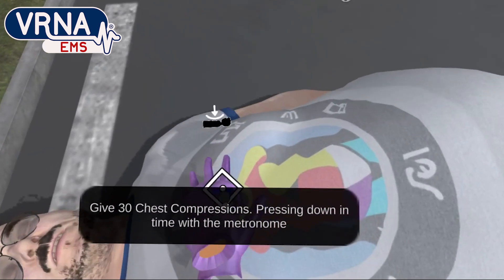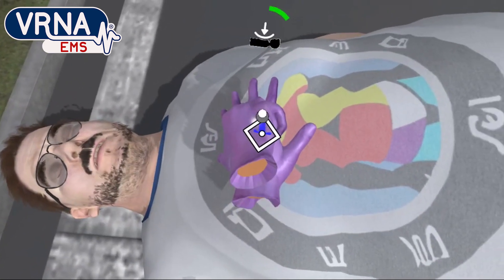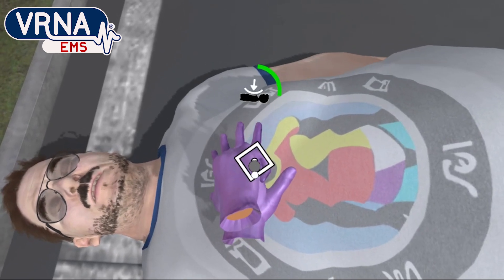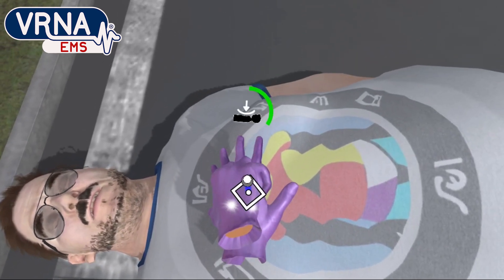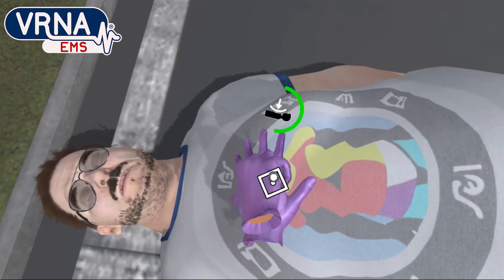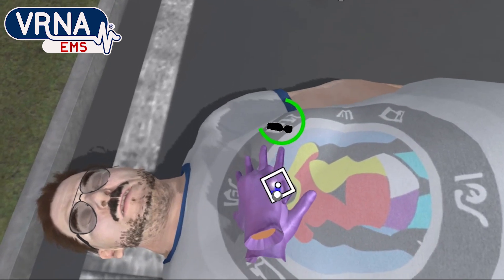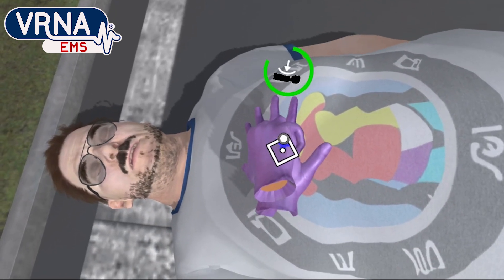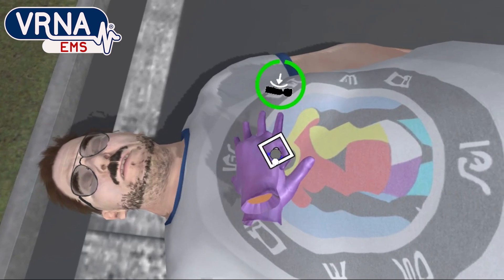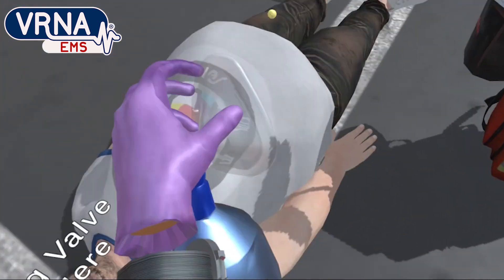Give 30 chest compressions, pressing down in time with the metronome. Give two rescue breaths using the bag valve mask.